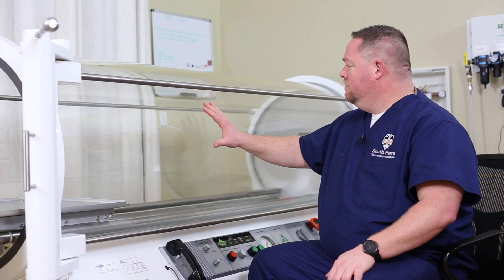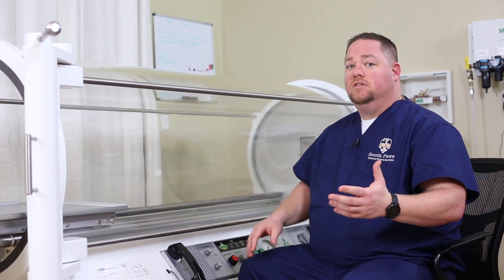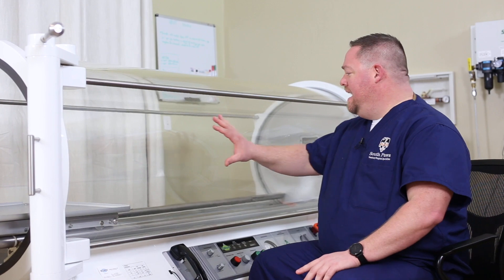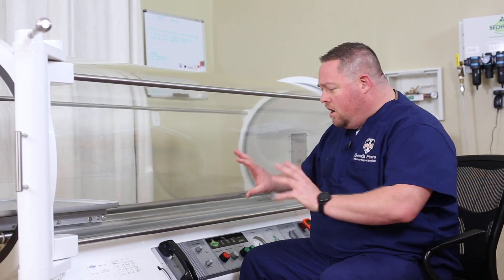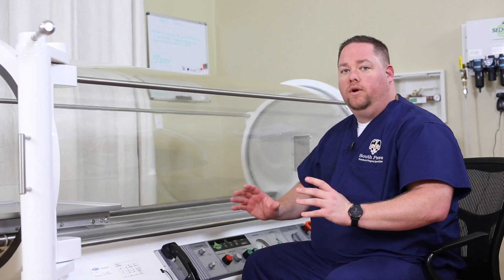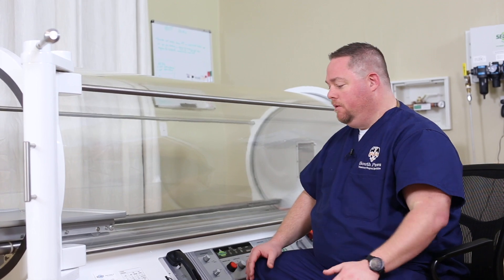The thing that I love about it is the visualization of the patient. With hyperbarics, monitoring that patient is really important for things like oxygen seizures or other issues. Now we have a full look at our patient when they're in there, and we're not trying to look through a small porthole or anything, so I think this is a huge benefit to having the acrylic base chamber.